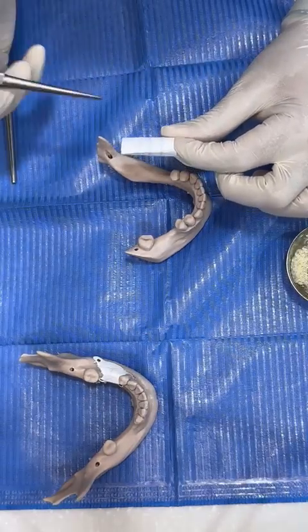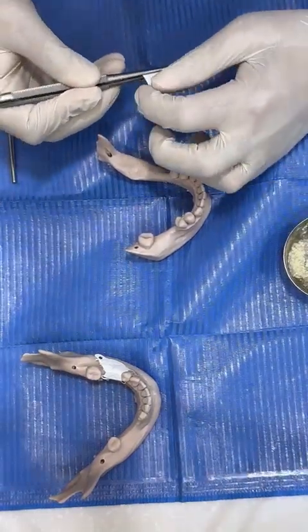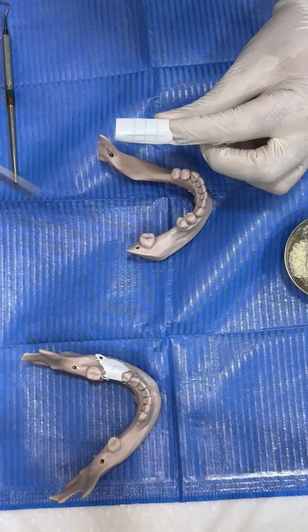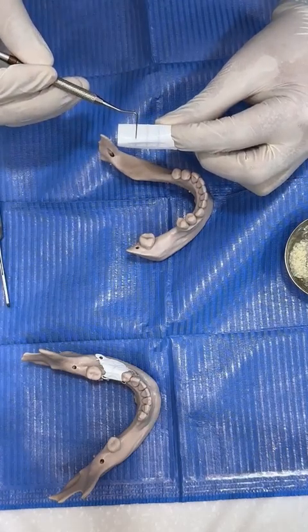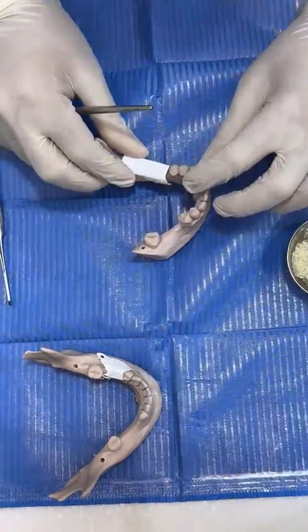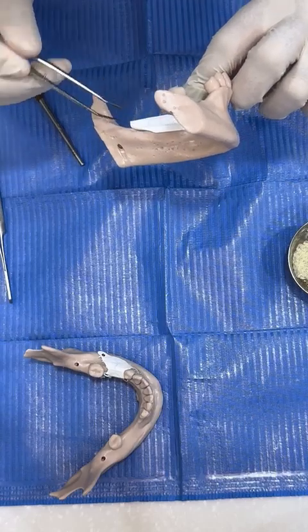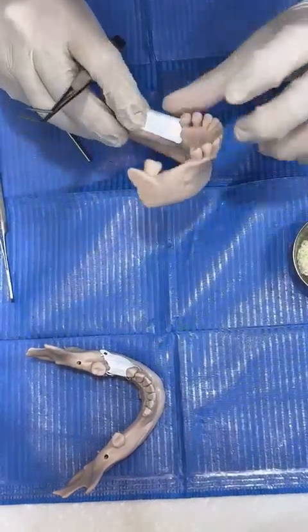So I am going to use the membrane like this. Okay. Now it's 10 here, and it's almost 12 in this area. Okay, now I want to check the adaptation of the membrane. This is where I can fix the membrane. I have to check where I'm going to fix, make sure I'm covering this area.